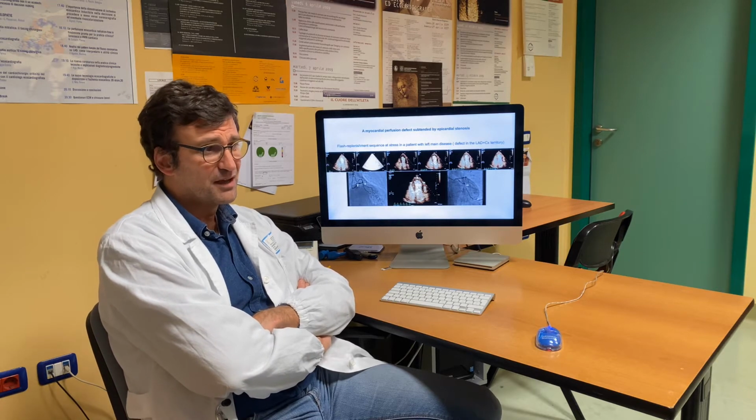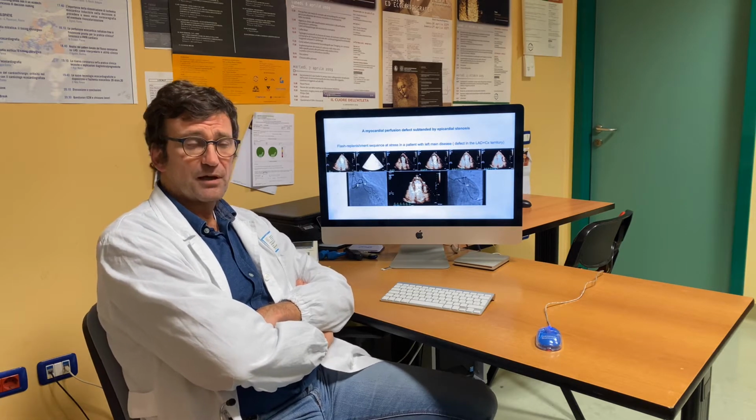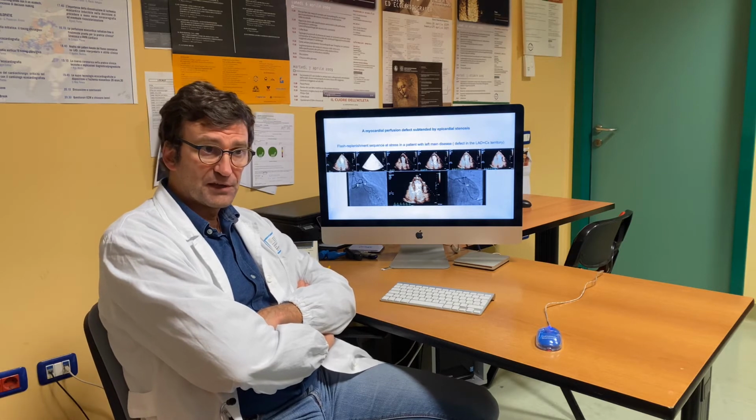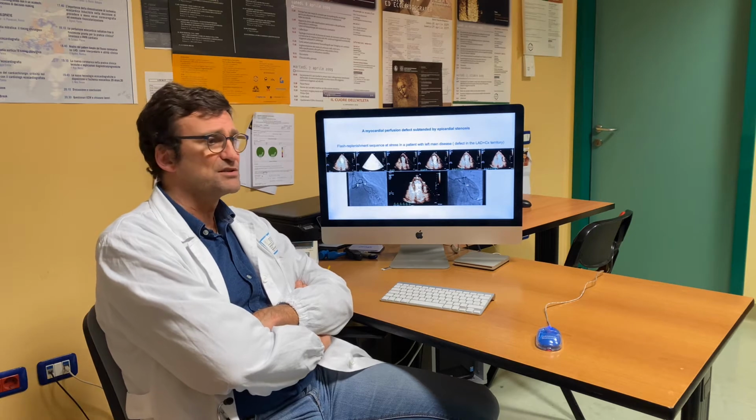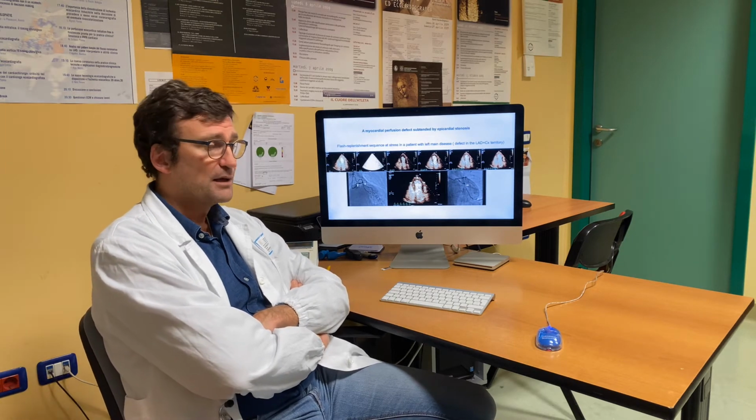But obviously, there are also some drawbacks. You have a little bit of noise, and so the signal to noise ratio is not as good as you can find in CMR or PET imaging.